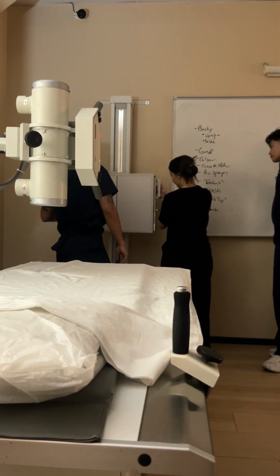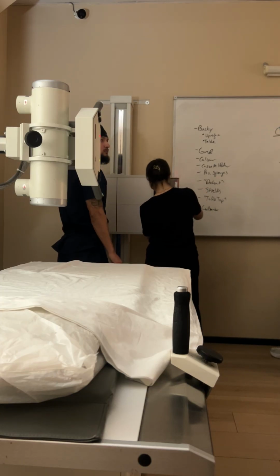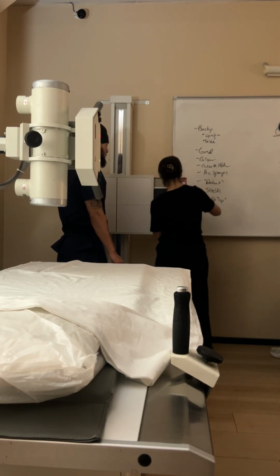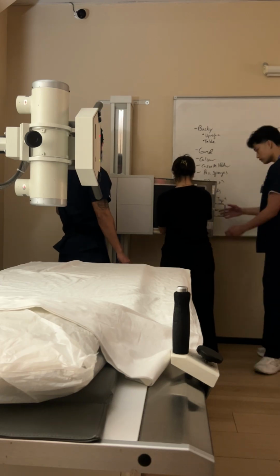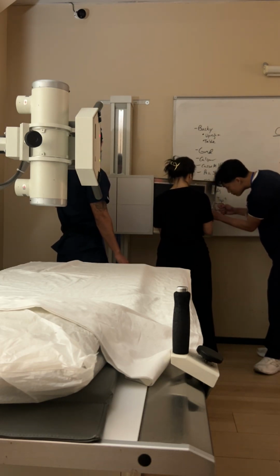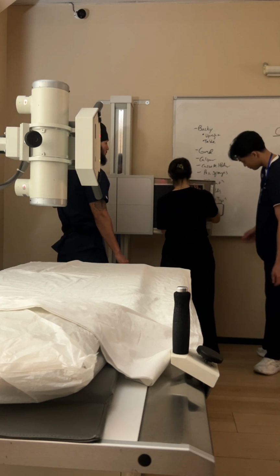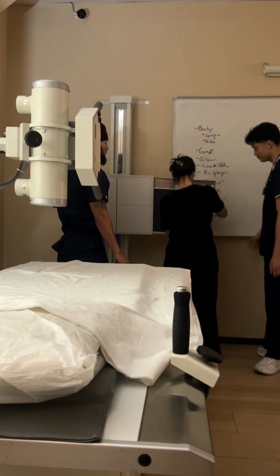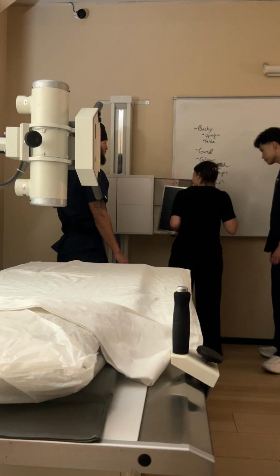When we're doing a PA, does this need to go on the left or the right? If you're doing a PA, it needs to go on the patient's left. If you're using a left marker, it needs to go on the patient's left. If you're using a right, obviously it goes on the right. But you have to do the left first. Left lateral. But you can use either your right or your left for a PA or an AP, because you can see both sides at once, right?